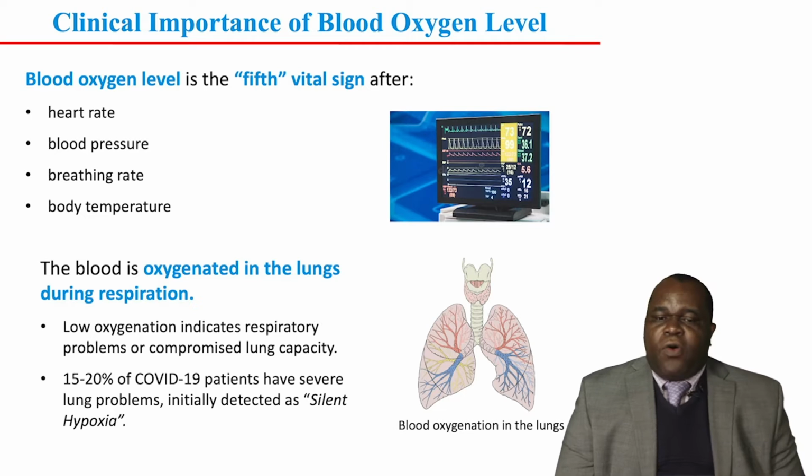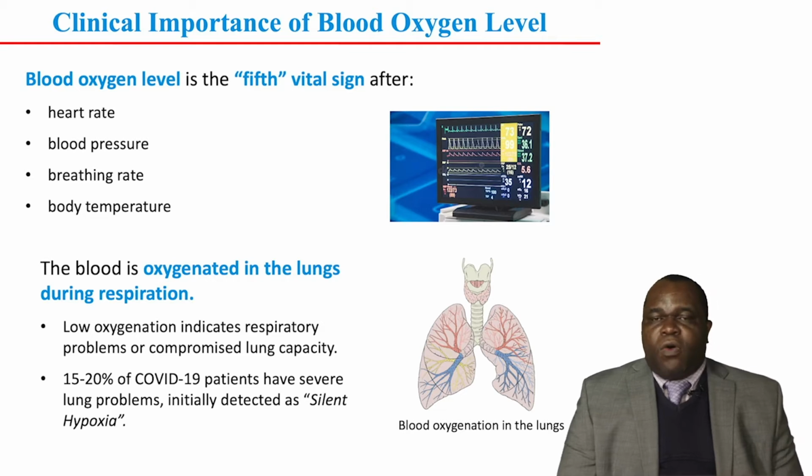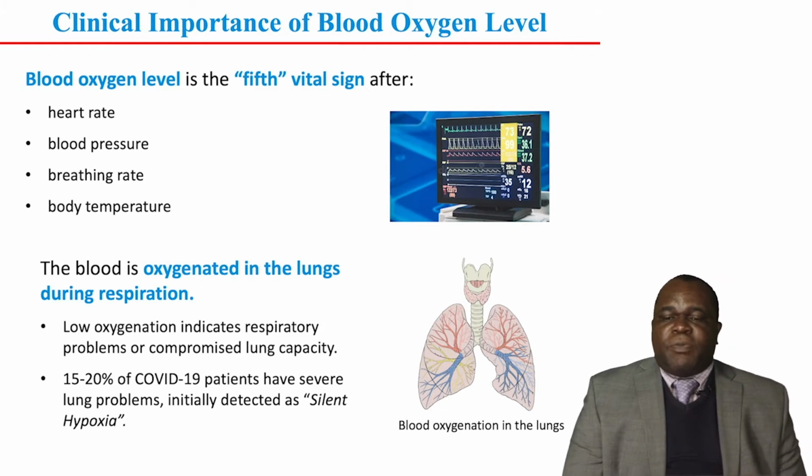Blood oxygen level is clinically important because low oxygen can lead to organ failure as well as brain damage. So together with heart rate, blood pressure, breathing rate, and body temperature, it is measured and monitored as the fifth vital sign.